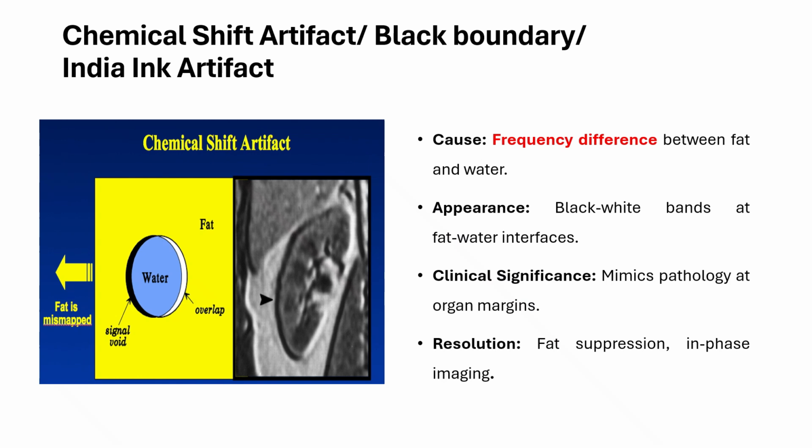Its resolution is by fat suppression or in-phase imaging, and the mnemonic to remember in the exam is the fat versus water tug of war.